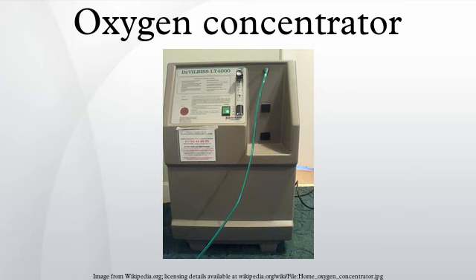Non-medical oxygen concentrators can be used as a feed gas to a medical oxygen system, such as the oxygen system in a hospital, though governmental approval is required, such as by the FDA, and additional filtering is generally required.